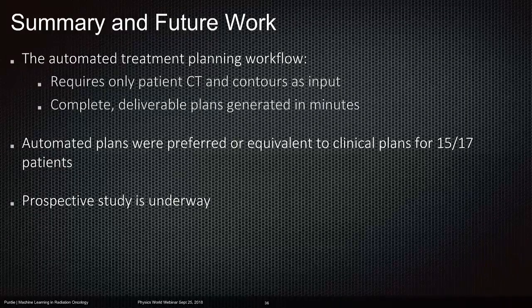What you should do when training machine learning models is to have a validation or test set where you can test the model, and then you can look at the result in terms of maybe the average result on this validation set or the worst case behavior. What we see is that for planning and segmentation, 100 patients or plans seems to be a reasonable number. Tougher geometry needs more training data.